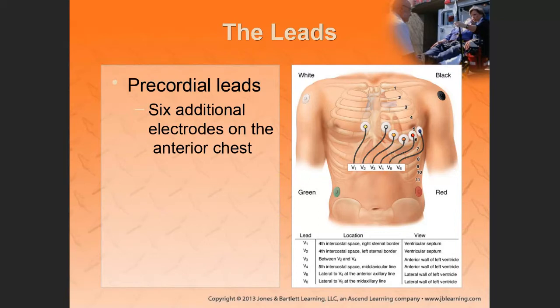All right. Now, if you're doing a 12 lead ECG, and we're talking about all the leads now, chest leads and limb leads, which leads would look at the left side? It cannot be one lead, Mr. Duane.